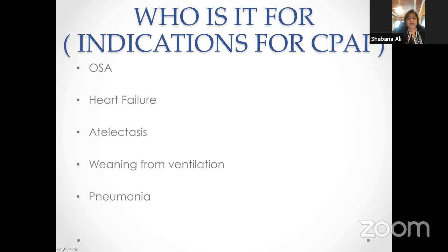The other one is weaning from the ventilator. If the patient is on invasive mechanical ventilation and you want to give a try to see if the patient can tolerate extubation, the CPAP mode is one of the modes of ventilation that you use, to see how the patient is breathing and whether he is ready for extubation. And of course, pneumonia. CPAP does not treat the pneumonia, but it reduces the work of breathing, which we always see in pneumonia.